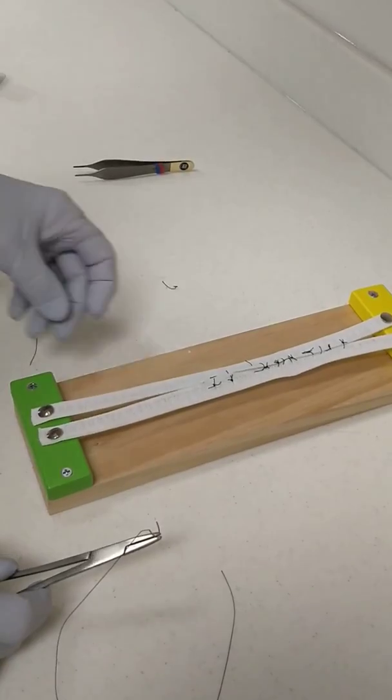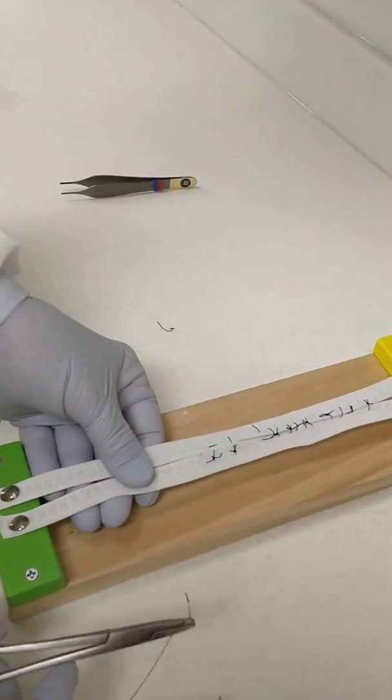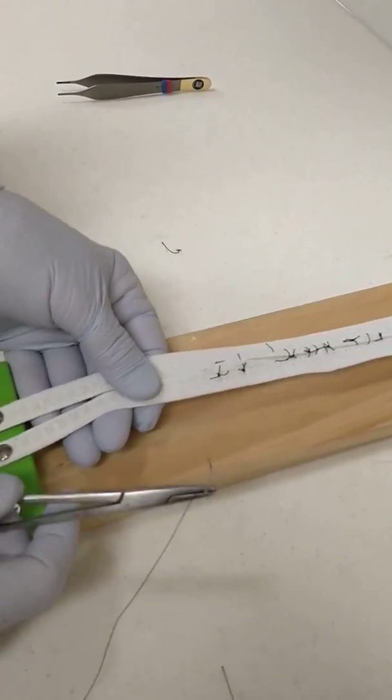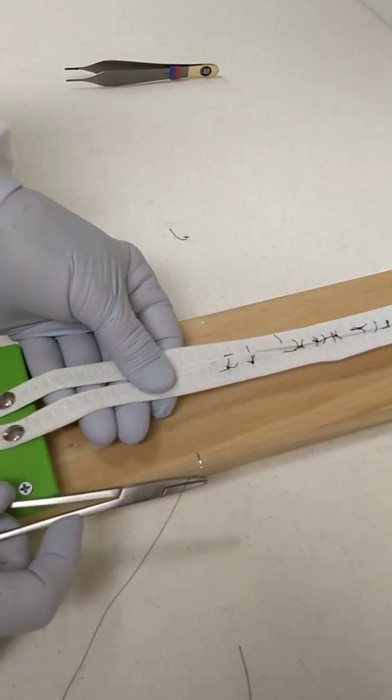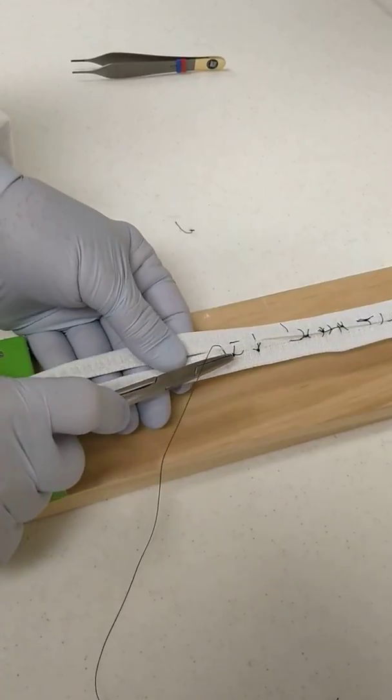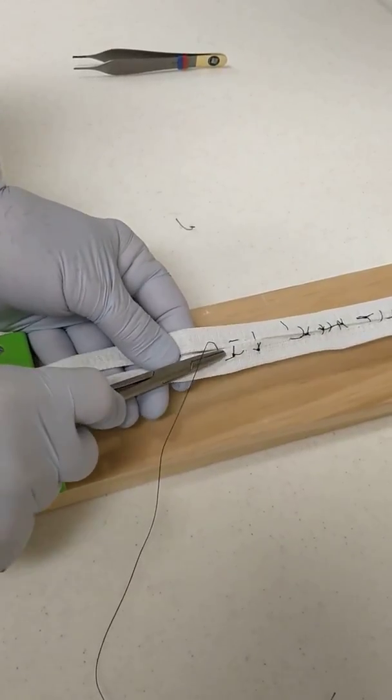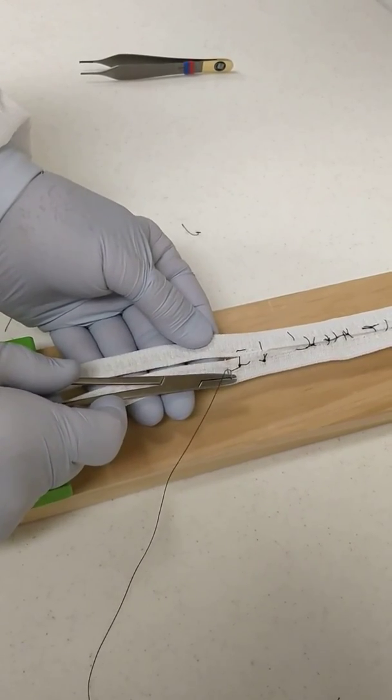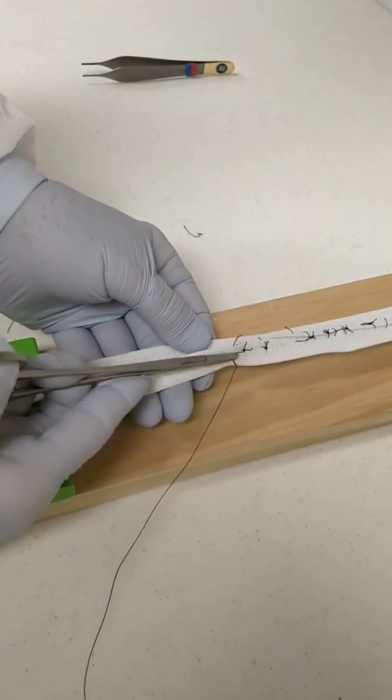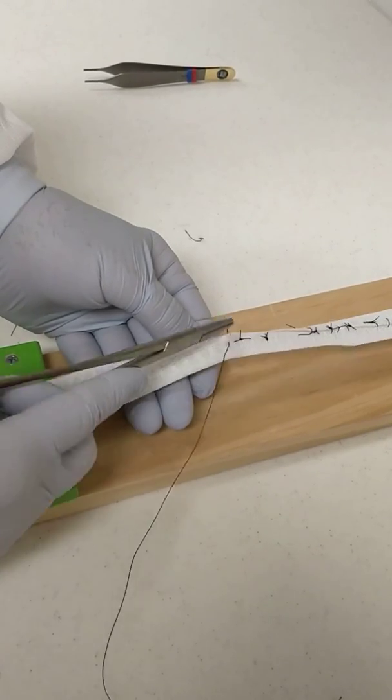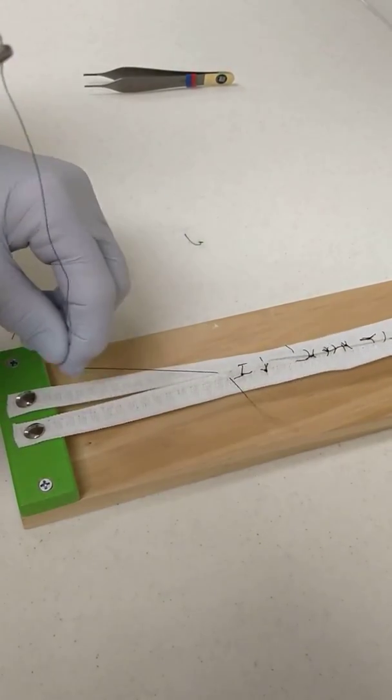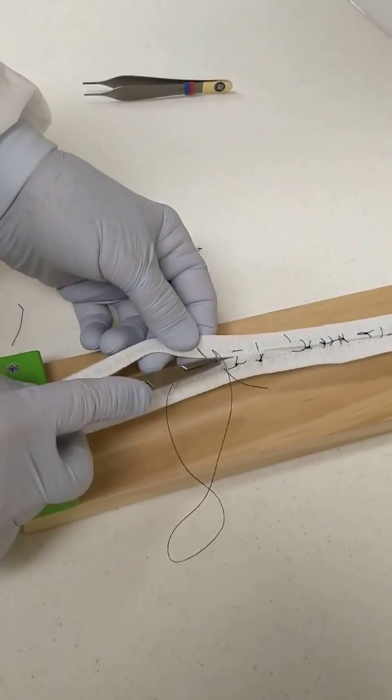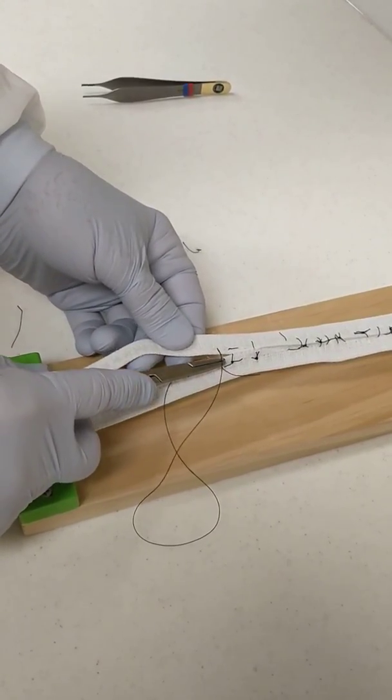A third type of suture that we often use when we're doing grafting of sockets is a figure of eight suture. This is done by passing the needle through the tissue, through one side, and going down one notch.